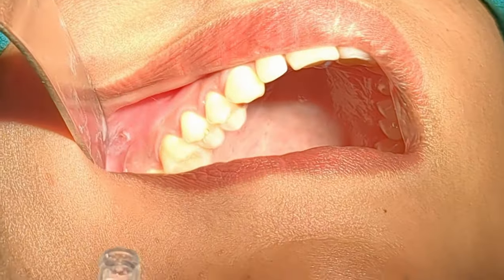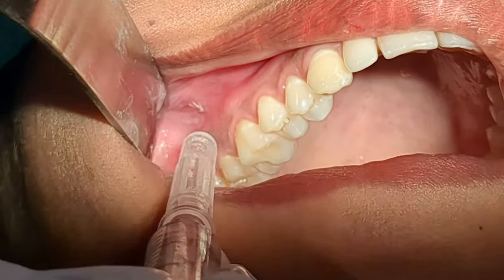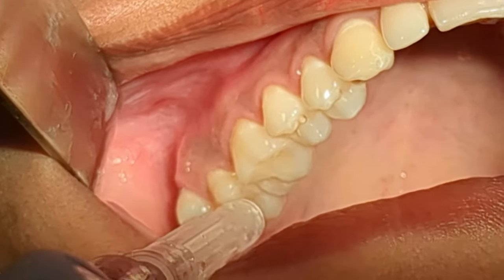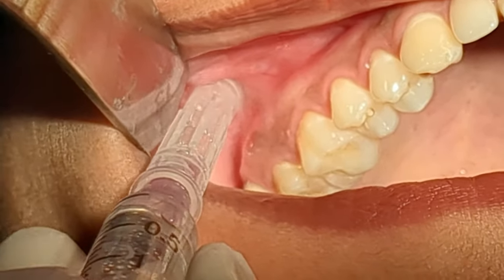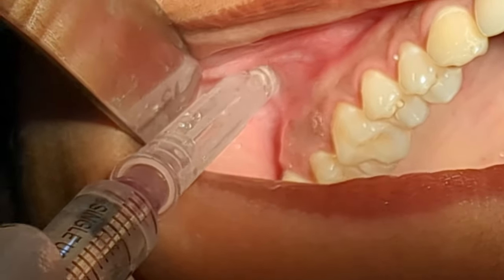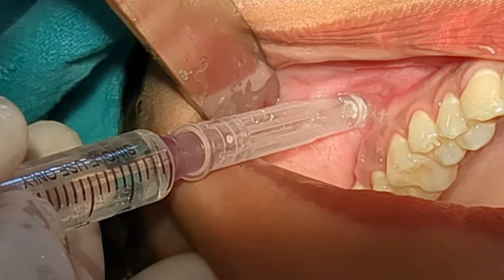For PSA you just need to remember two things. One, the needle insertion — it has to be at the depth of the mucobuccal fold at the apex of the second molar. This is the mucobuccal fold, and here you are going to insert the needle. The angulation should be 45 degrees upward, inward, and backward to the occlusal plane.